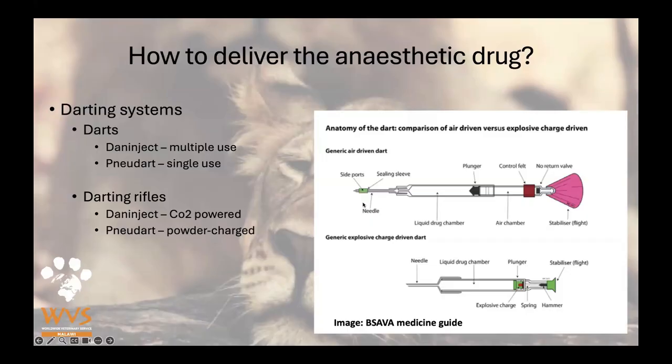So there are quite a lot of steps in this. It's definitely very important in the beginning, especially when you are new and you're nervous. There's a lot of things that could potentially go wrong. If you pressurize this dart while the sleeve is not on, it will just go everywhere in the air. So obviously this is also a safety risk. They are great, I'm using them a lot, but it needs concentration. There are quite a few steps involved to make up this dart.